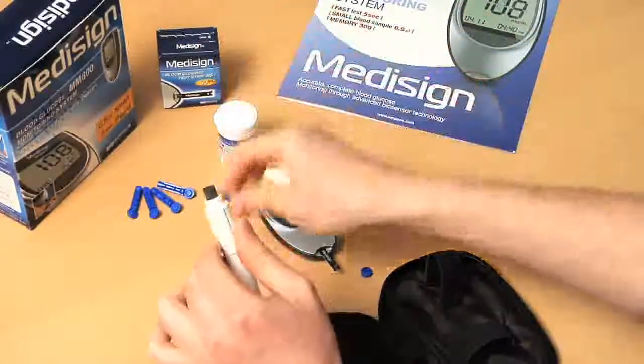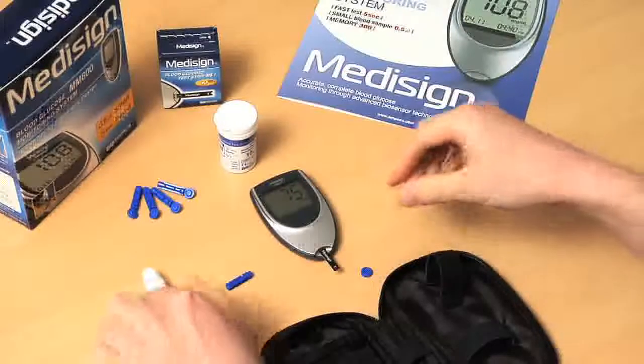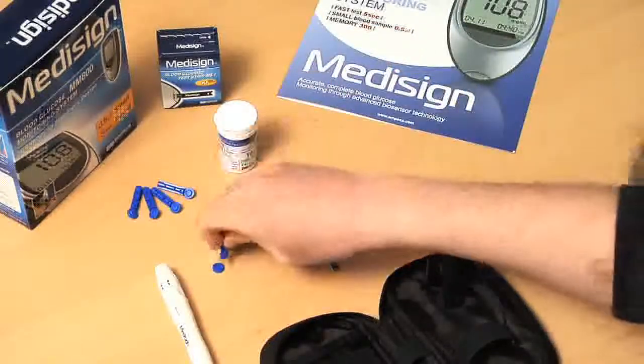Finally, remove the lancet from the lancing device. Put the tip of the lancet on the removed disc to discard it.